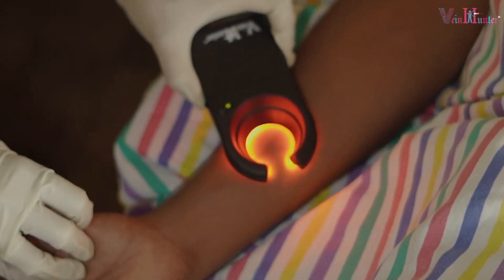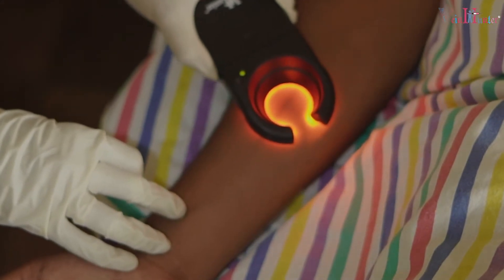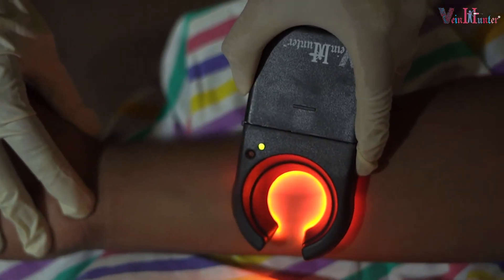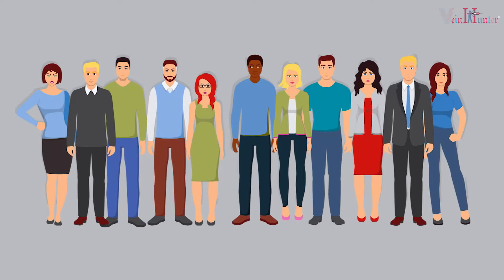As you touch the patient's arm, put some pressure on the skin with Vein Hunter for best output. Then move it across the arm to scan and locate the vein. For different kinds of skin, you have to adjust the light intensity accordingly as per your convenience.